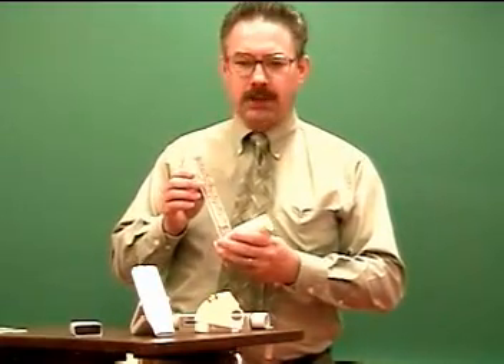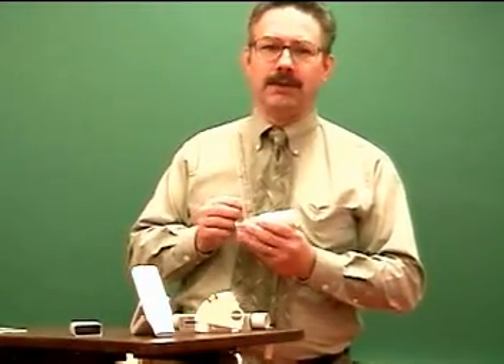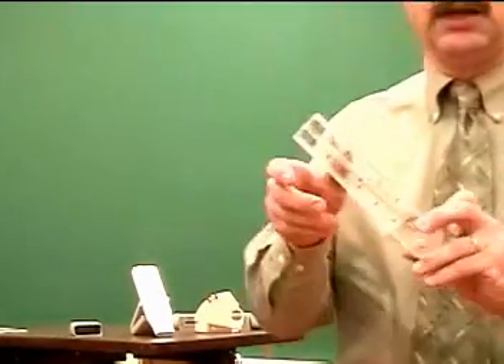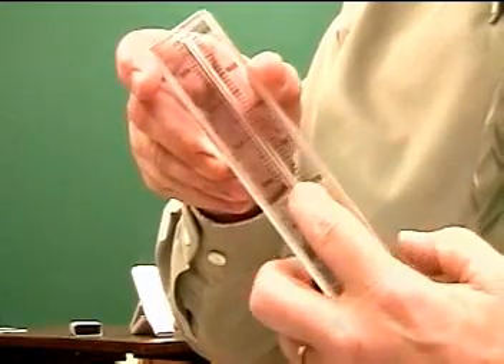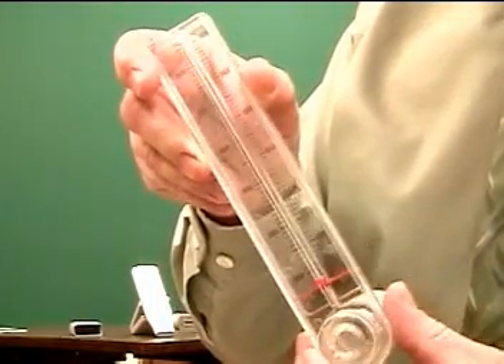First, select your peak flow meter and then you'll want to make sure that you zero the indicator. In this case we can see that there is an indicator — this little red dot here — pull it all the way down to zero.